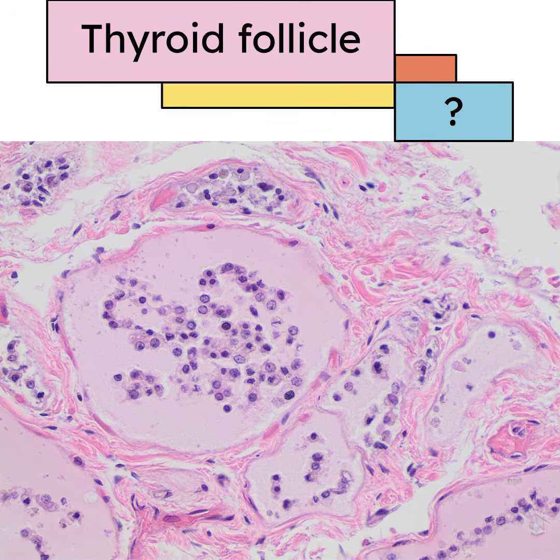While the architectural integrity is compromised, the underlying thyroid structure remains recognizable, allowing for the exclusion of systemic diseases that might have affected the gland prior to the cessation of life. Final recognition of autolysis depends on the global nature of the changes throughout the entire specimen.